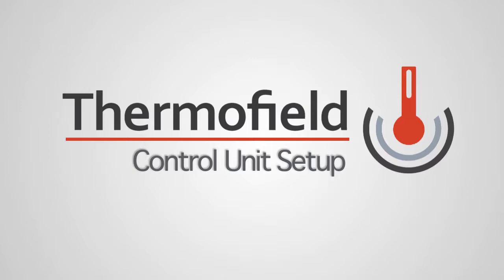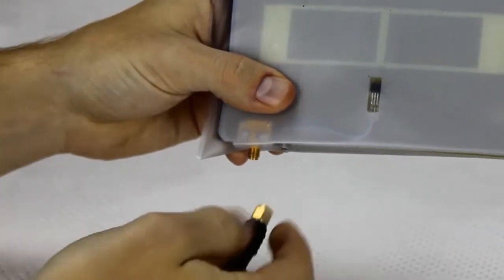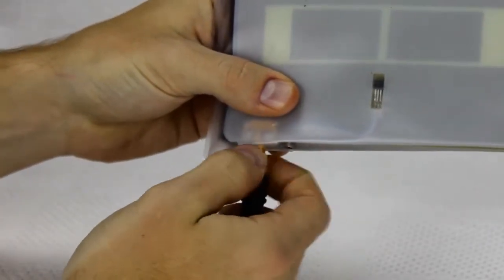After you have the unit plugged in, connect the cords to the applicator pad. To connect the black cord, twist the tip of the cord until the cord is tightened onto the applicator.